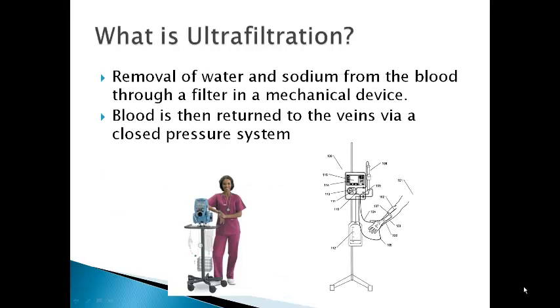And what is ultrafiltration? It is the removal of water and sodium from the blood through a filter and a mechanical device, seen in the lower left-hand corner. The blood is then returned to the veins via a closed pressure system. You can see on the right-hand corner how this is hooked up to that patient's arm.